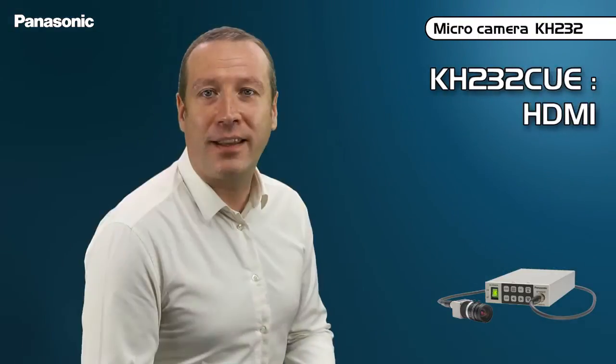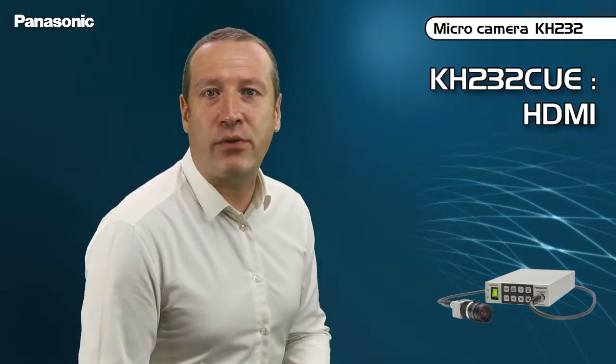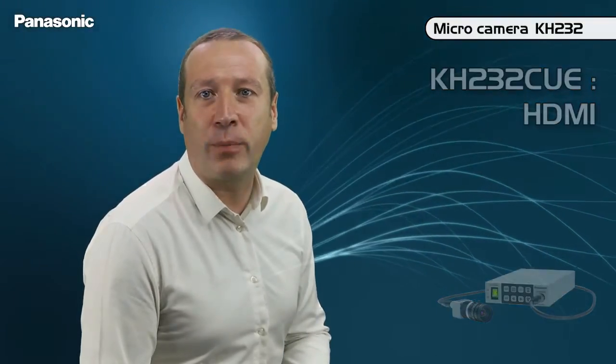Two control units are available. The KH232 CSE, which has many SD or HD video outputs such as HDMI, component, or SDI. The KH232 CUE, on which the SDI connector is replaced by an SD-only S-video output.